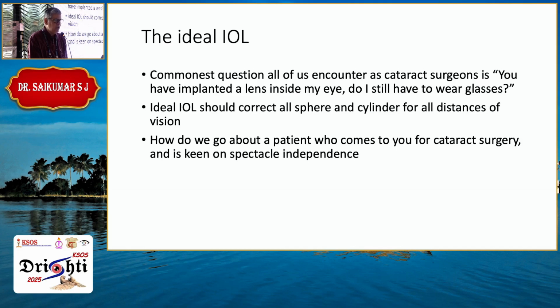So ideal IOL should be something which corrects everything. Your cylinder, your sphere, your distance vision, your intermediate vision, your near vision. We unfortunately don't have a lens which fits into everything, but we have certain lenses which sort of get us there with some caveats along with that.